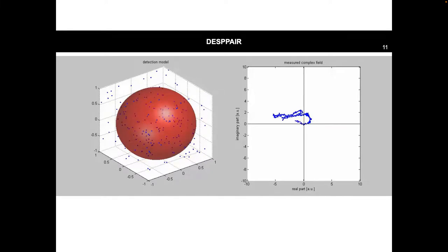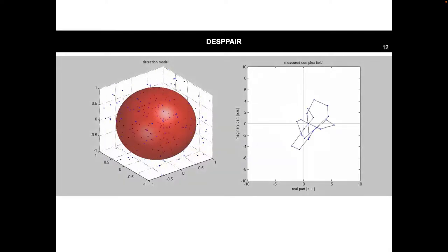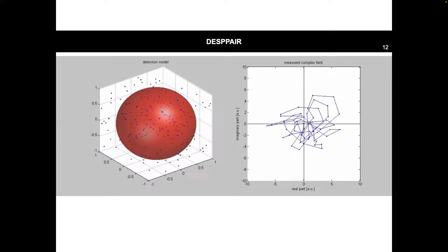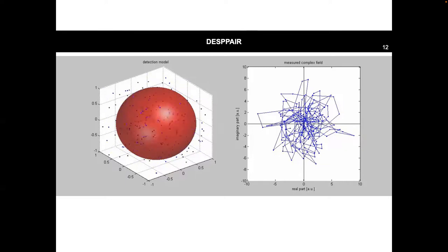If you don't believe me, the change would be more dramatic if it flows faster. Yes, of course. And so that is my second animation where we move a little faster. Right. And so you know now that the transversal flow in the retina, for instance, can be quantified by looking at how this phasor changes. And now you need to come up with math to quantify that.